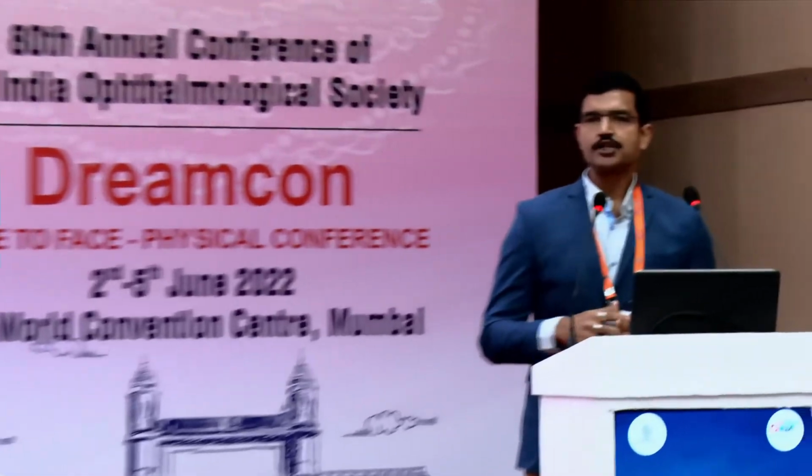What I do is, if the posterior capsule is already open, I do not go in with the vitrector, because once you remove some amount of vitreous from the area and create a gutter there, the epinucleus tends to drop down even to the center of the vitreous cortex. So I use the IOL optic as a nudging device: keep retracting it towards me and then leave it. Keep retracting it towards me and then leave it. The IOL optic nudges against the epinucleus and lifts it up to the surface of the optic, and then it can be consumed easily. So I don't disturb the vitreous face much and eat away the superficial vitreous cortex while the epinucleus is still lying there.